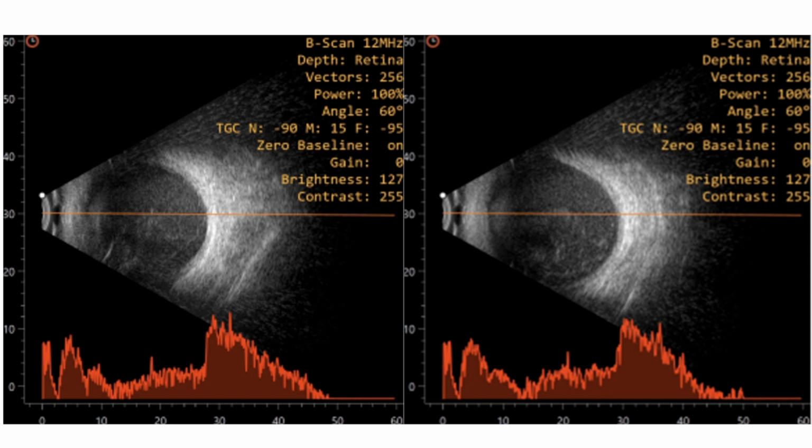What happened to the fundus view? What happened to the hypopyon? So the hypopyon was persistent and the fundus view was still hazy. There was no difference in the fundus haze. Yes. Okay. So the repeat ultrasound showed a comparatively higher amount of dot reflective echoes in the vitreous cavity. The retina was attached.